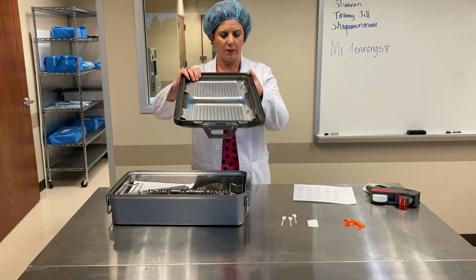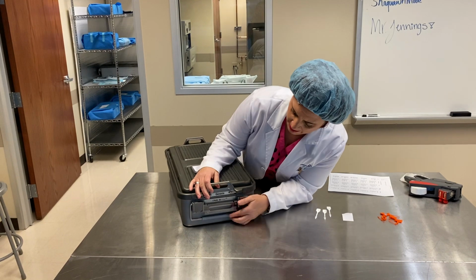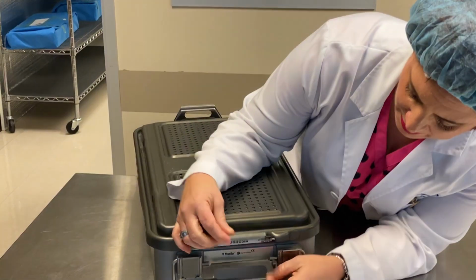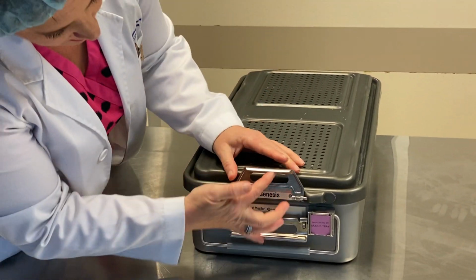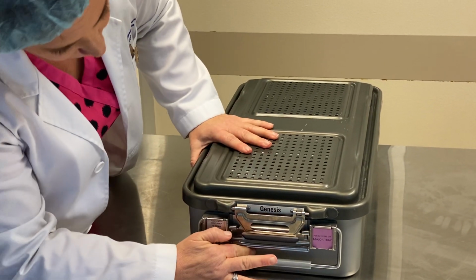What we're going to do is put this on here, and there's this latching mechanism. If you look here, this little hook is going to hook onto this ridge right here. You're going to push that down. Same with the other side here. You can see the hook and this little ridge. Push that down, lock it down.